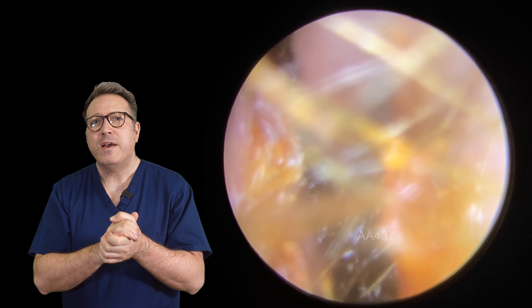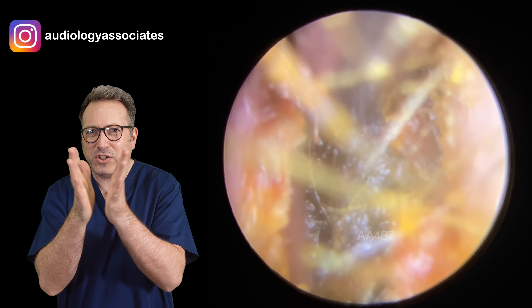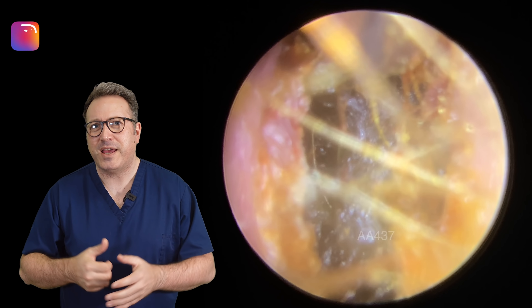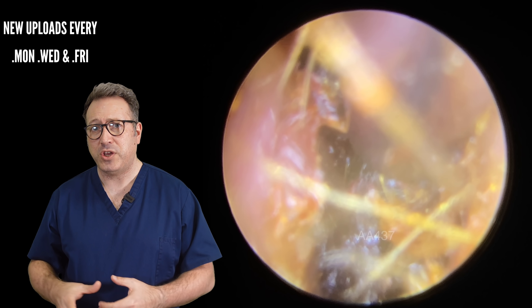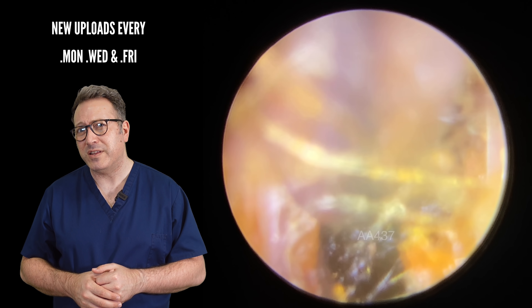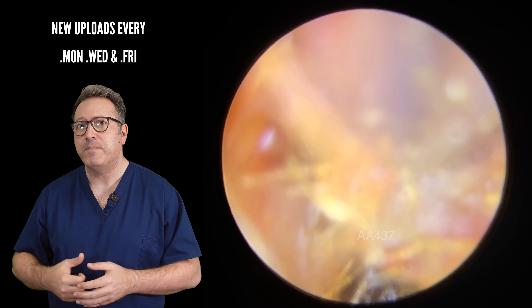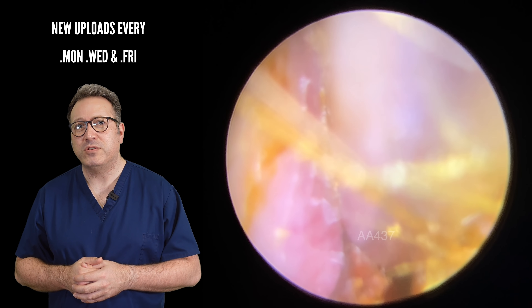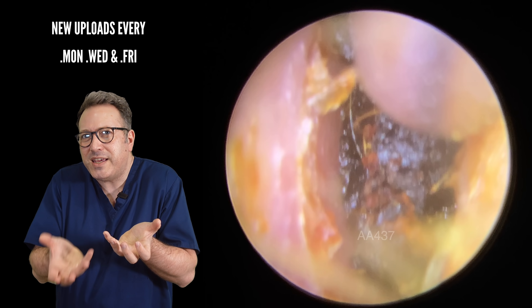We're going to draw this out. Unfortunately the patient also had a really awkward shaped ear canal — a slightly narrow section — and we're just trying to pull the whole piece through this narrow section. It had been in there such a long time that it had perfectly formed to the shape of the canal. We're getting a good grip, trying to wiggle the top section through, very, very gently trying to work this out through that little narrowing. If we can just lift up from the bottom, detach some of the looser material and bring the stickier side of the wax underneath — but it's pretty firmly wedged in there.